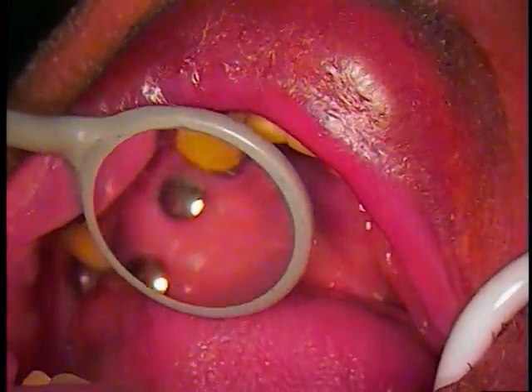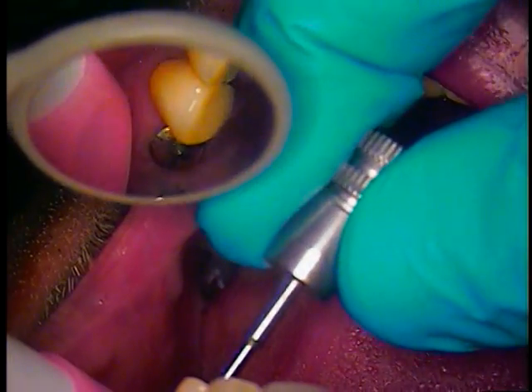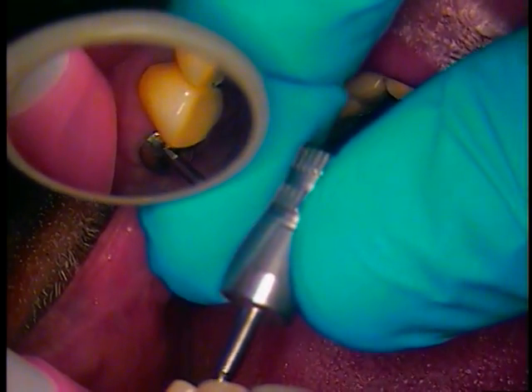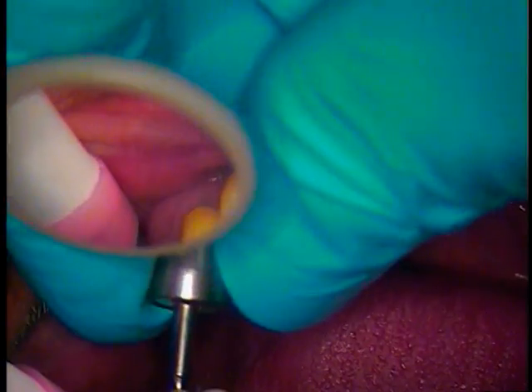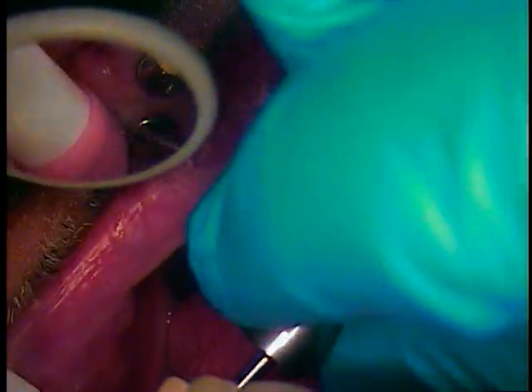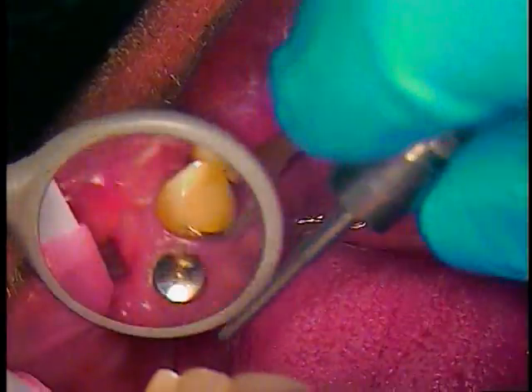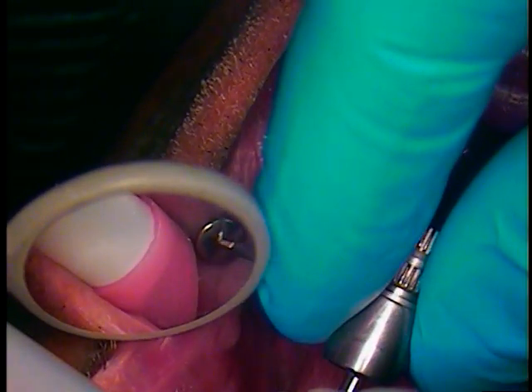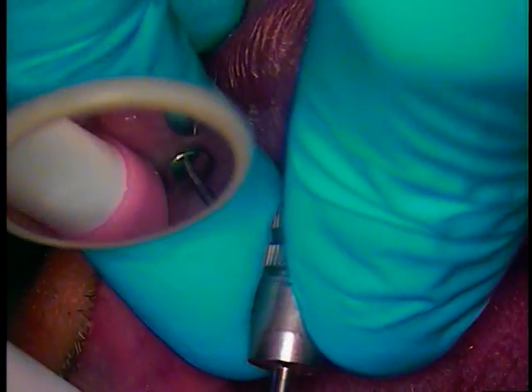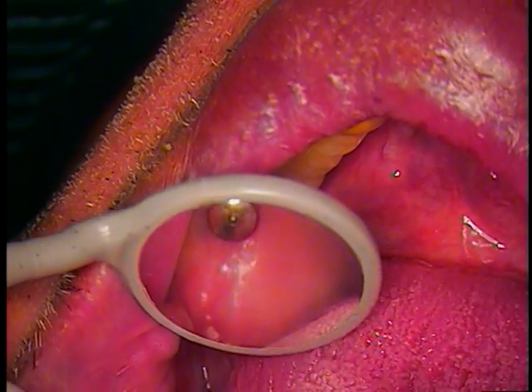Retract the cheek. Good luck. These are the gingival formers. Out, please.